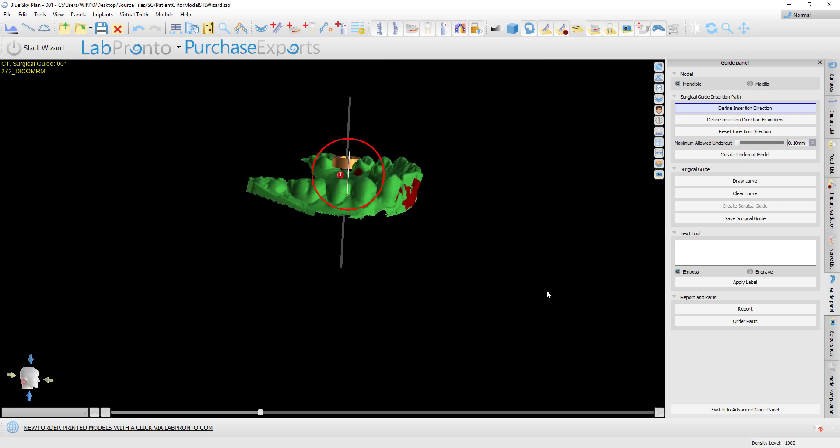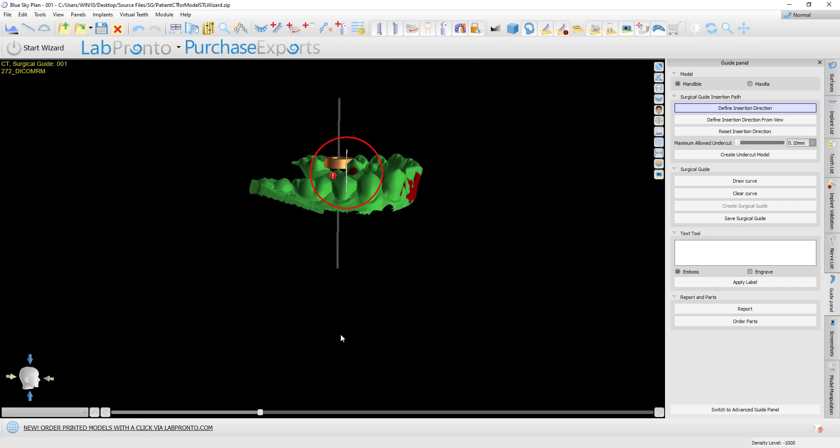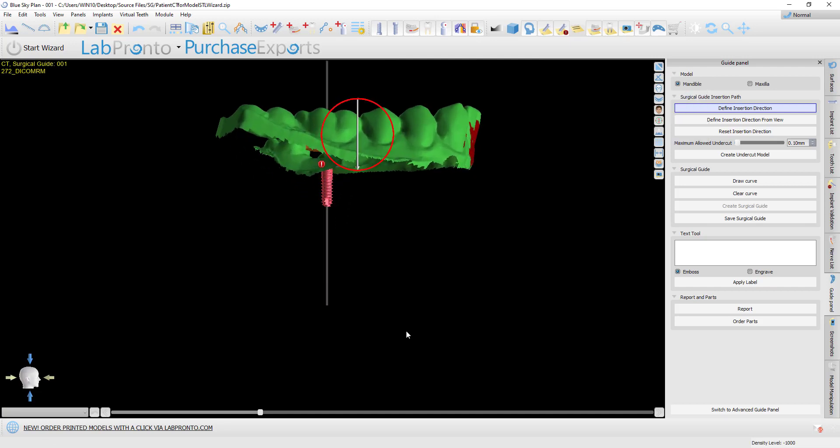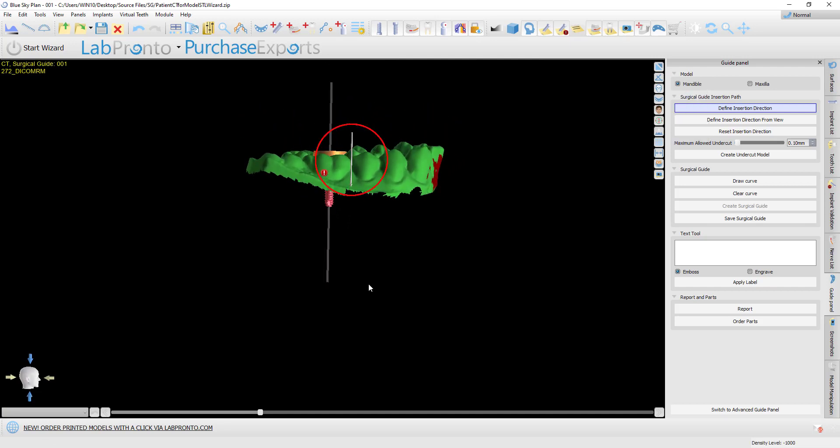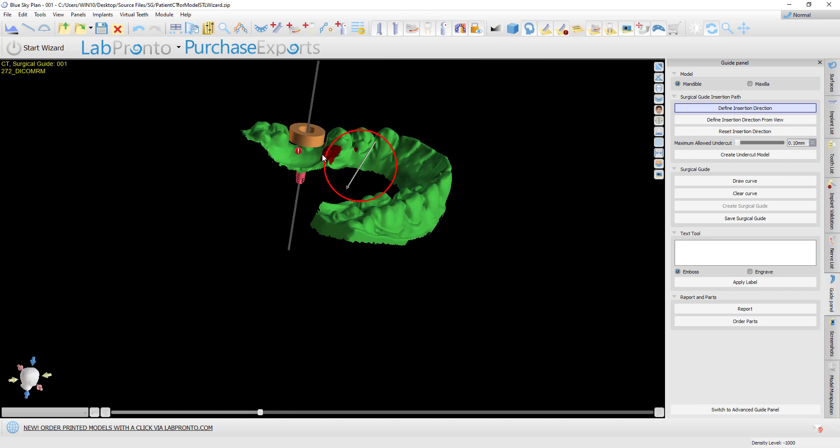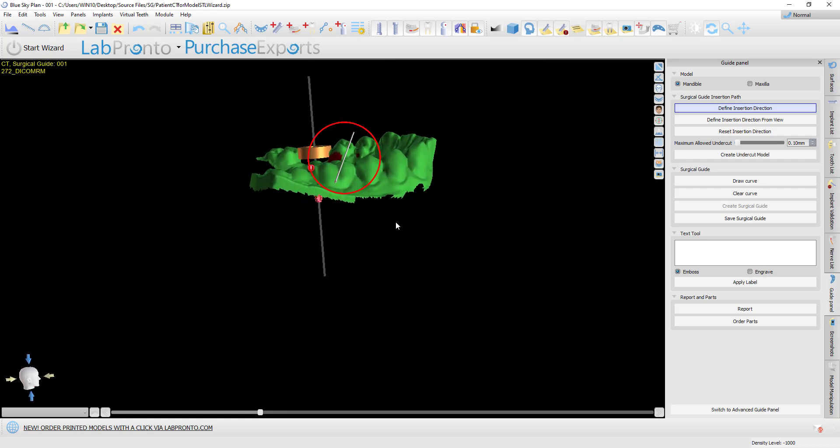If we wanted to define a 30-degree path of insertion similar to the wizard default, we could simply angle the arrow to add our relevant angulation, and again we can see the undercuts that will be removed.